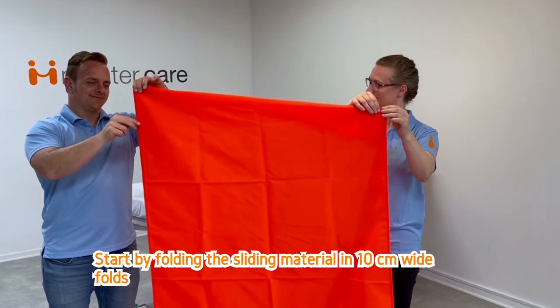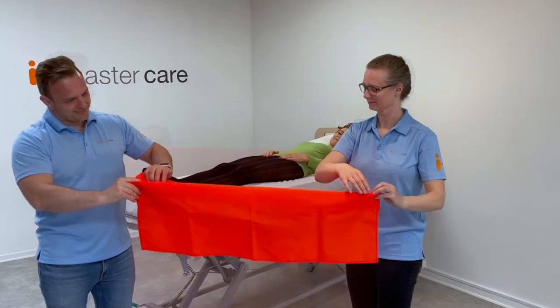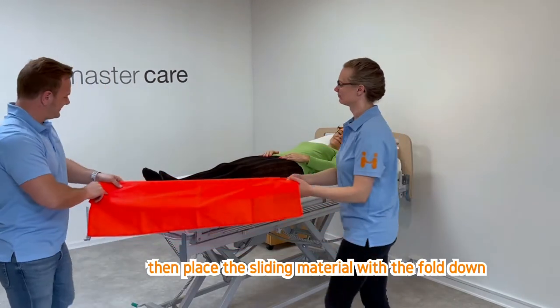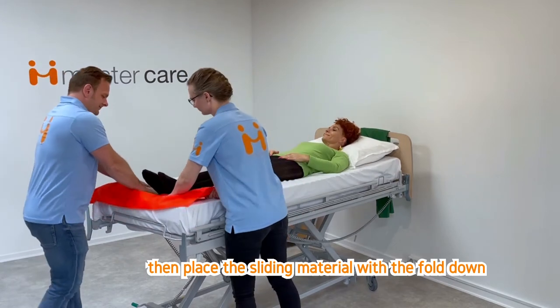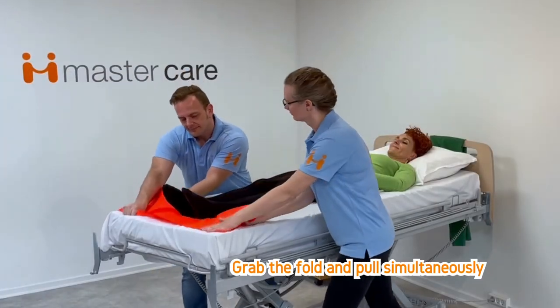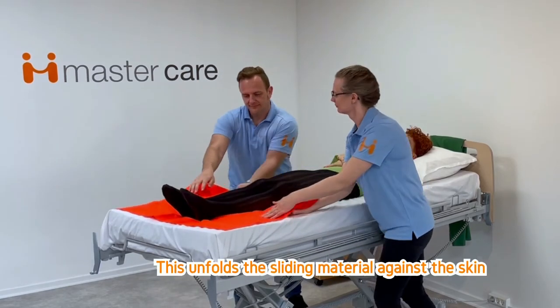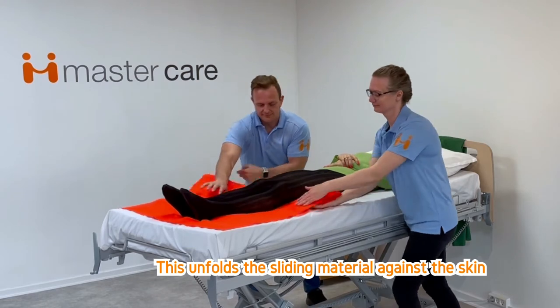Start by folding the sliding material in 10 cm wide folds. Then place the sliding material with the fold down. Grab the fold and pull simultaneously. This unfolds the sliding material against the skin.